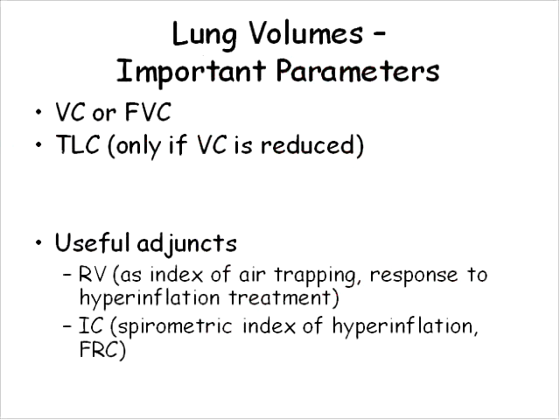However, it may be worth considering that the vital capacity tells us most of what we need to know about the total lung capacity. So consider that the vital capacity in healthy subjects makes up 70 or 80% of the total lung capacity. If we know that the vital capacity is normal, that effectively rules out restriction in almost every case. So as a clinician, you should think about whether measuring total lung capacity and residual volume are going to add anything to the clinical question that's being asked of the test.